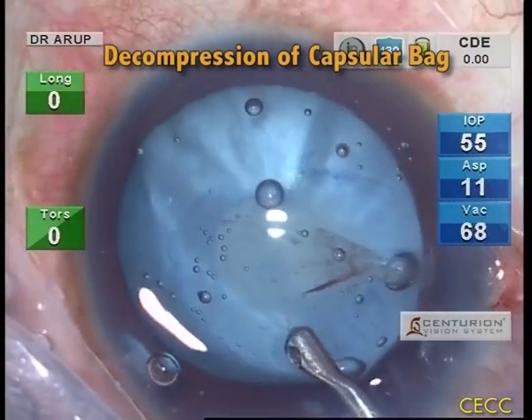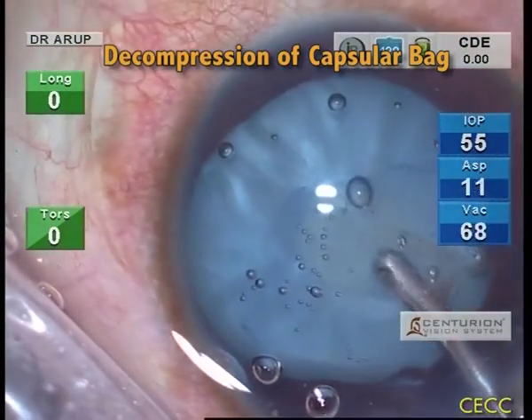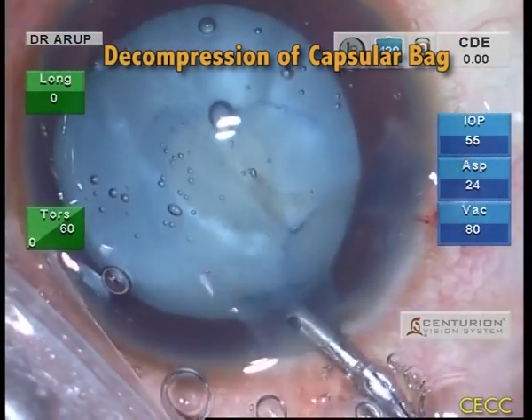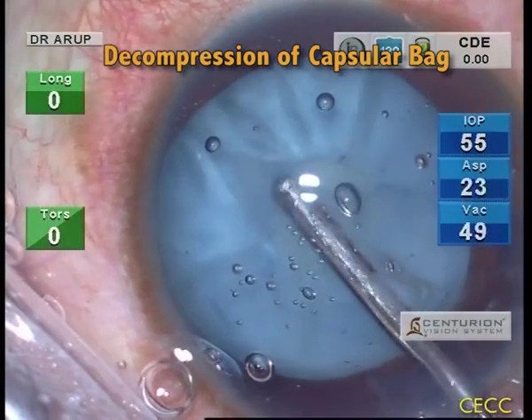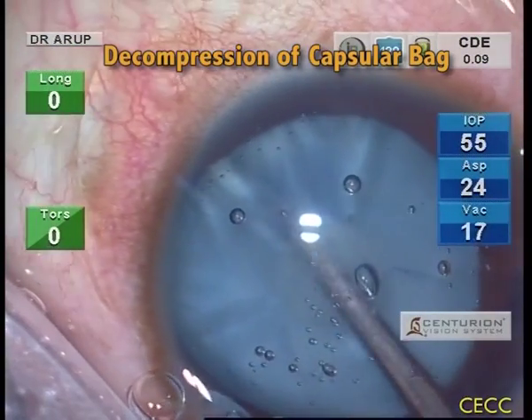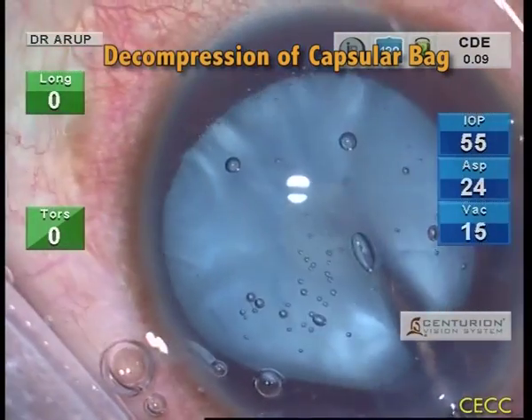Healon V is burped out of the incision to facilitate decompression of the capsular bag. The irrigation cannula is passed into the bag to flush out the flaky lens matter, and it is necessary to burp the OVD out of the chamber. Care should be taken not to laterally stretch the RHEXIS margins, which may tear particularly if the primary RHEXIS is very small.